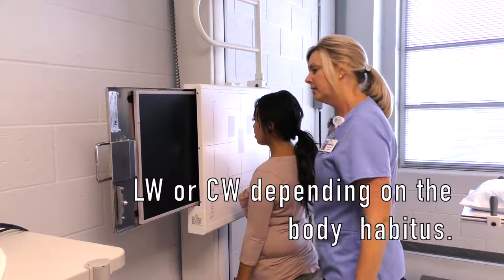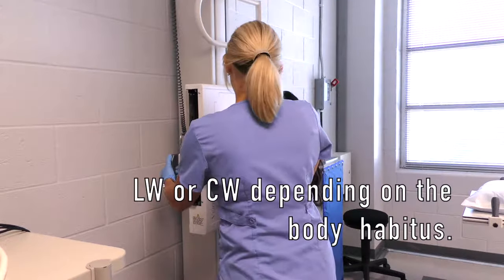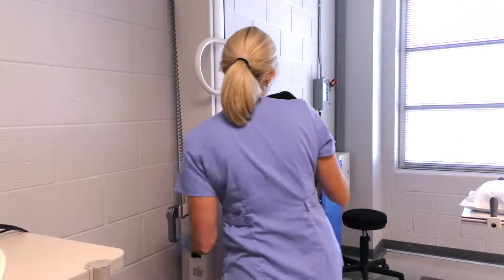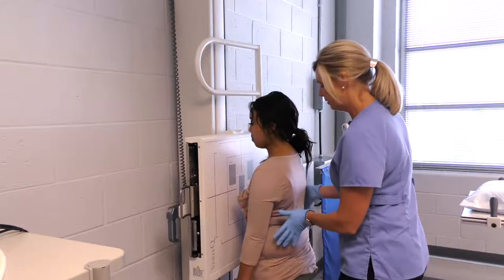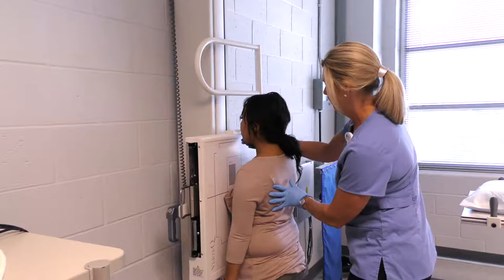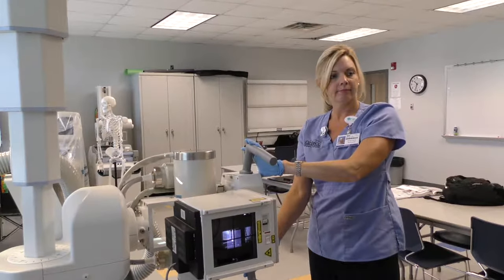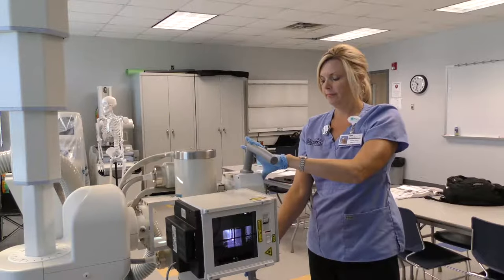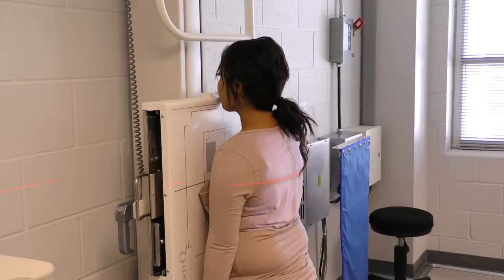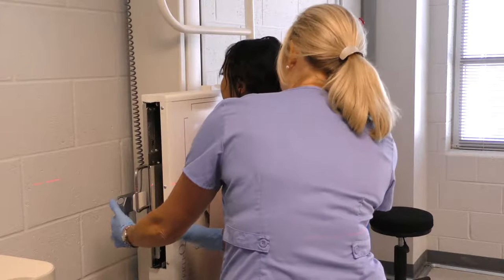We have our 14 by 17 cassette lengthwise. We're going to move the board down. Our centering is going to be — just take a step forward — T7. So we're already at 72 inches. I'm going to move my tube down to T7. We want the top of our light to be two inches above the shoulders.